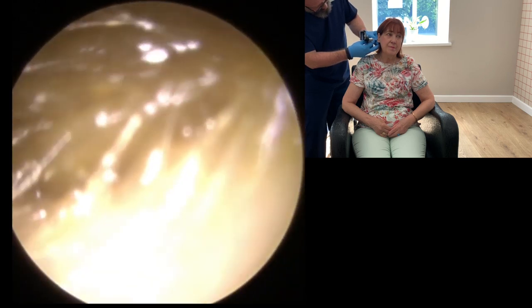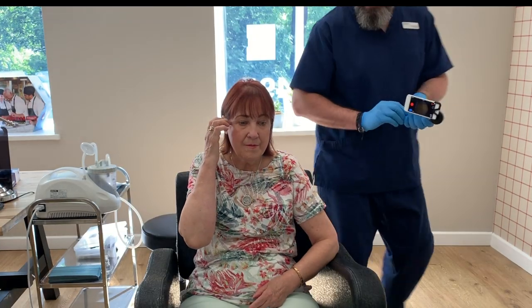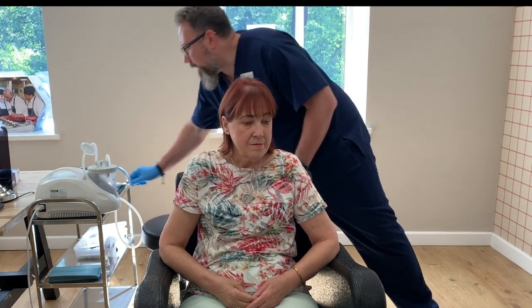I think the reason for that is this one is a little bit more sticky, and there's going to be a small gap above it. So what's happening is when your jaw's moving, the outer part of the ear canal is flexing and changing in shape, so the wax is kind of sticking against the canal wall. When the gap's there, the sound can get through. Yeah, because sometimes I have to hold my earlobe down so it opens — I think that makes sense.